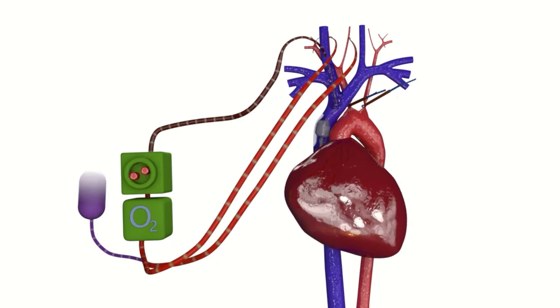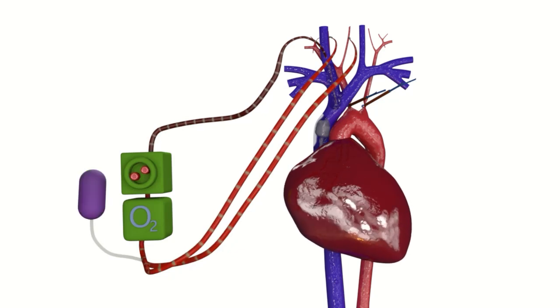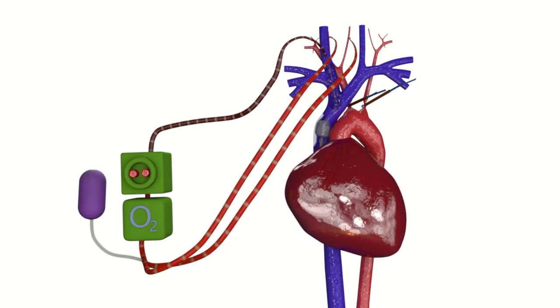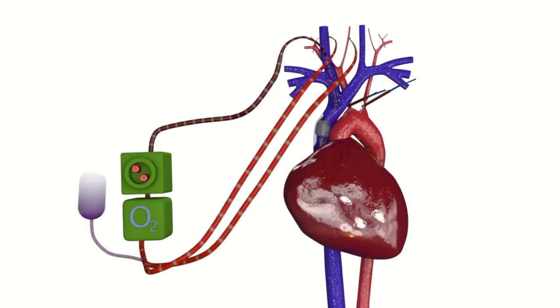After the therapeutic perfusion, the organs and tissues within the artificial circulation are flushed with an oxygenated solution containing prepared erythrocytes, colloids, crystalloids, a buffering agent, and albumin. The flushing process lasts 5 to 10 minutes and requires up to 3 liters of flushing solution.